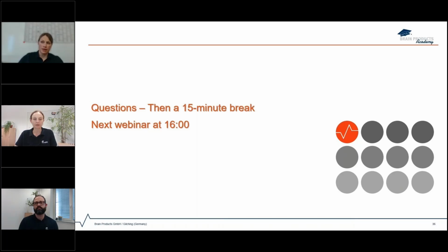Furthermore, there are many factors such as the vibration from the ventilation system of the scanner that can influence the EEG data, and it may be enough to try and pilot what your EEG data or your scanner static fields data would look like if you have the ventilation vibration as high as it can get, or if you turn the ventilation off, and then see whether you're able to remove some of that vibration noise from your EEG data.